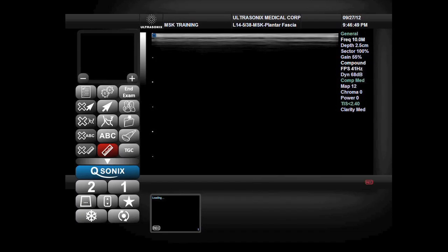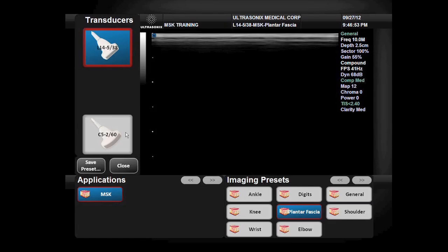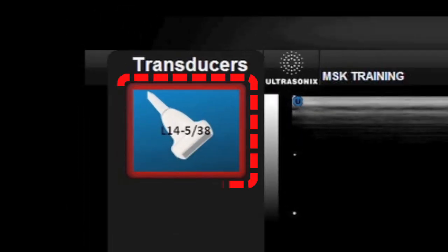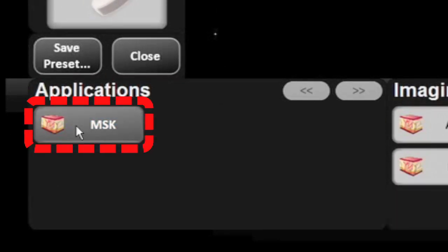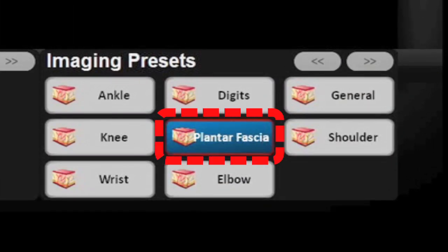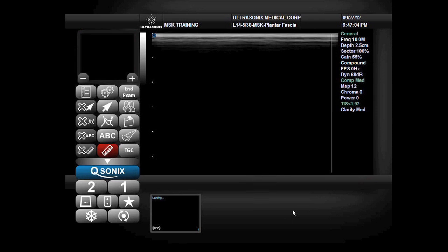To select the appropriate presets for the foot and ankle examination, we first select the appropriate probe. The high-frequency linear 14-5 is most optimal. We choose the MSK application and the plantar fascia preset.